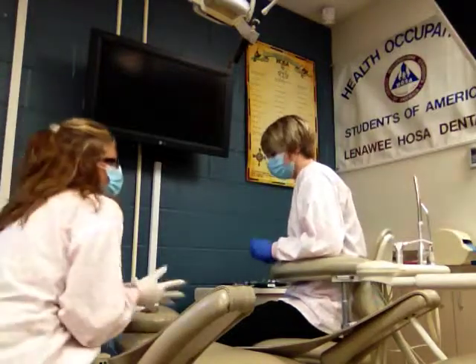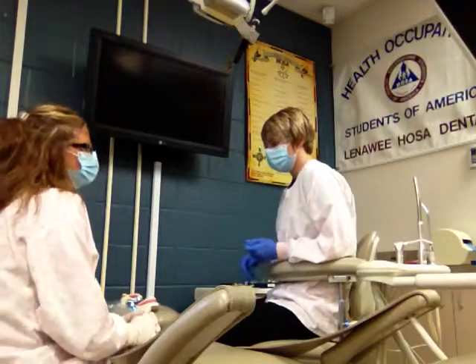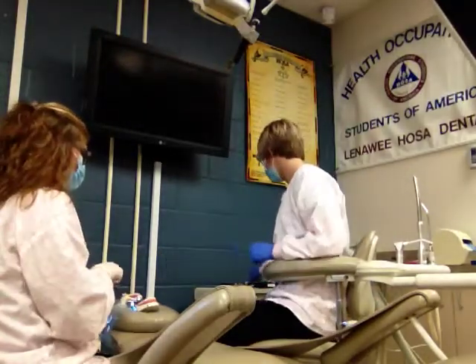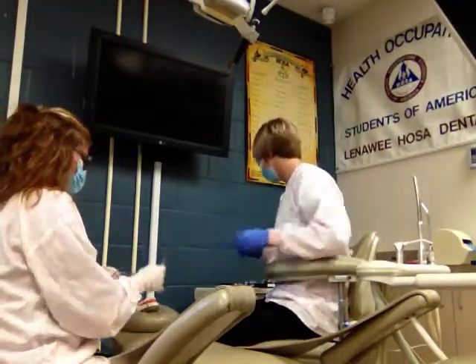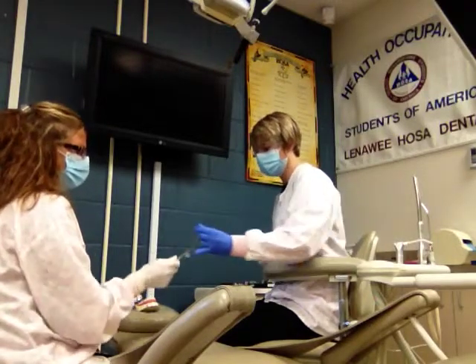Okay, this is surgery number 3 for skills. This is going to be a surgical extraction like a wisdom tooth. So we need the mirror and the explorer. And we're going to extract number 17, which is completely impacted underneath the gum line.